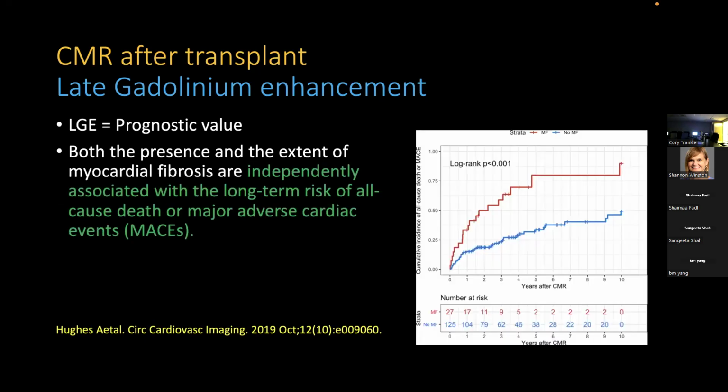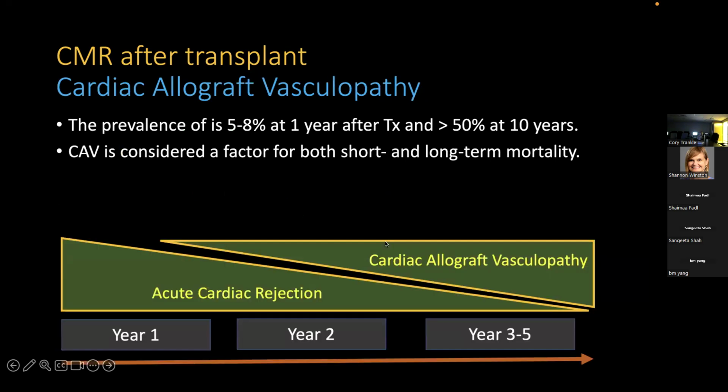It plays an important role in prognosis. Although most studies do not significantly correlate it with the presence of acute rejection, it is associated with long-term risk of death or major adverse cardiac events. So it has been linked to bad prognosis.